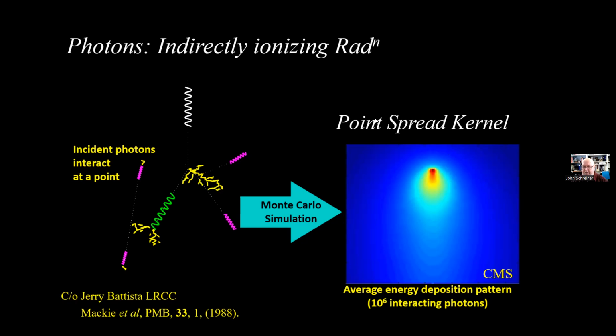One can imagine establishing a computer model: if I have some dose delivered by the photon at this spot, with energy transferred to charged particles, I can look at how these charged particles distribute that energy after this interaction has happened. So I have this map of how the energy gets distributed from this original interaction, and I can use this now to calculate what the dose would be if I have all kinds of photons coming in.